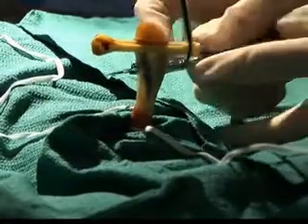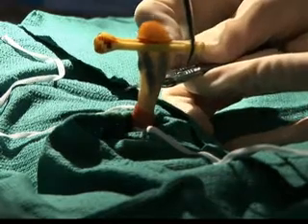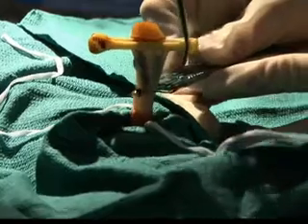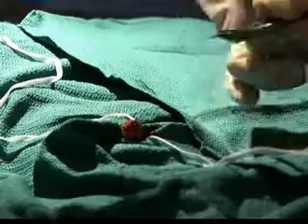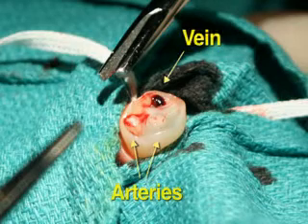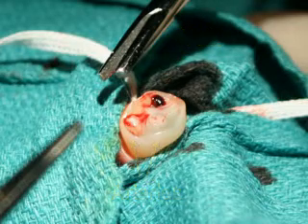Cut the cord horizontally with the scalpel, approximately 1.5 centimeters from the skin. Take care not to cut the skin that is at the base of the cord. Ask the assistant to remove the cut cord and clamp from the field. Identify vessels within the cord. Control any bleeding by adjusting tension on the umbilical tie and by blotting, not rubbing, the freshly cut surface.